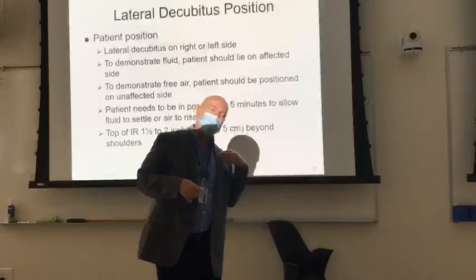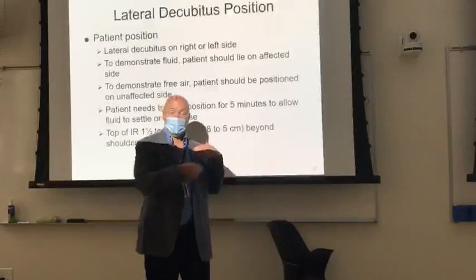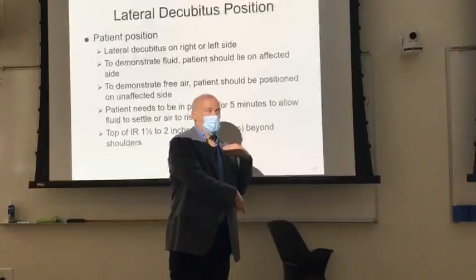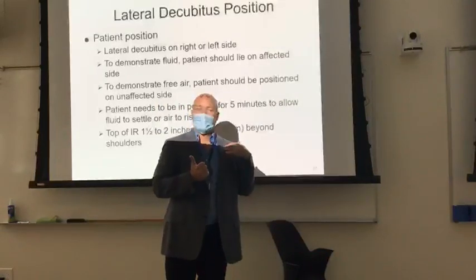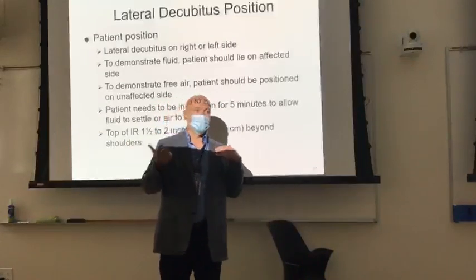We lay the patient on the left-hand side for pneumothorax. Where's that air going to go? Is it going to go down? No. It's going to go towards the right side, right? So what do you have in the mediastinum that's full of air too?